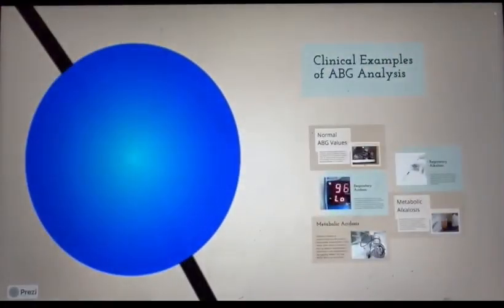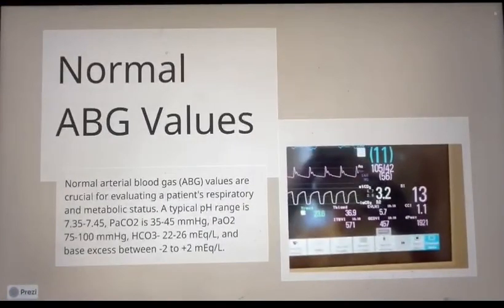Next are some of the clinical examples of ABG analysis. Normal ABG values. Normal arterial blood gas values are crucial for evaluating a patient's respiratory and metabolic status. A typical pH range is 7.35 to 7.45.